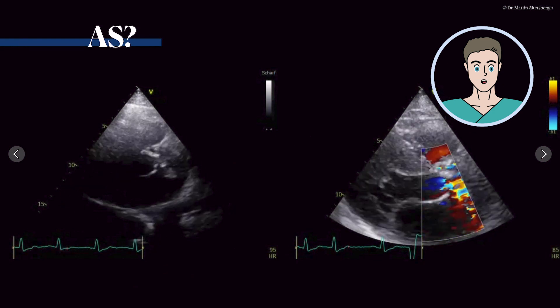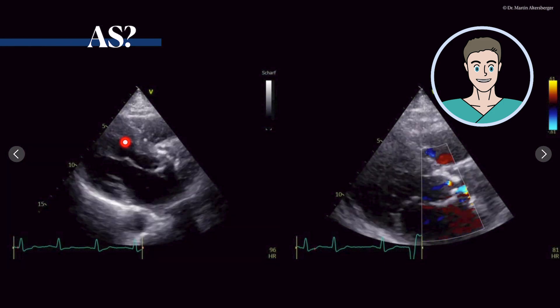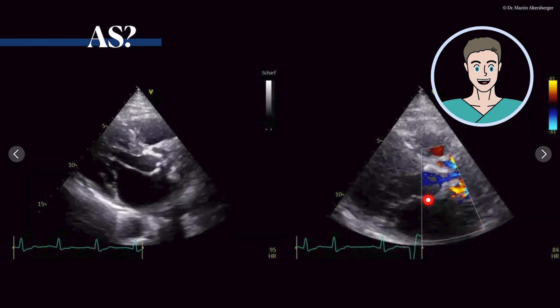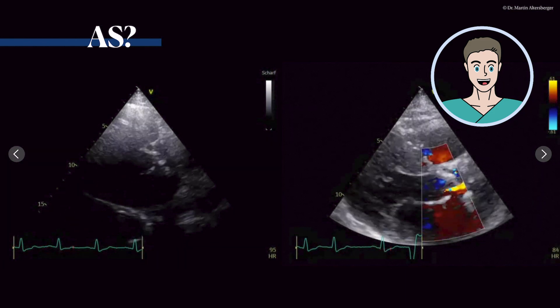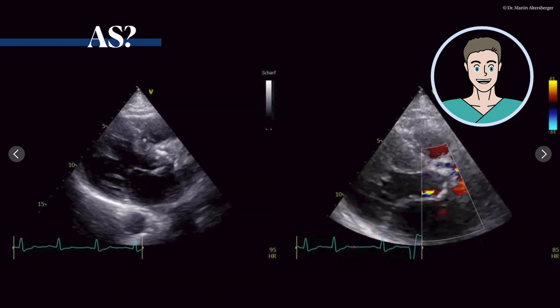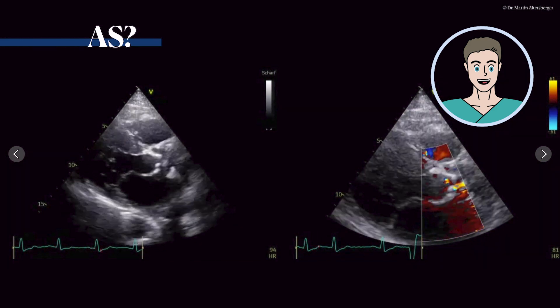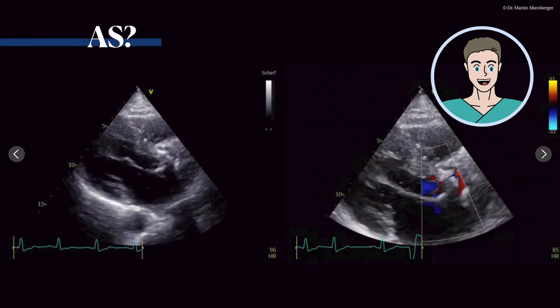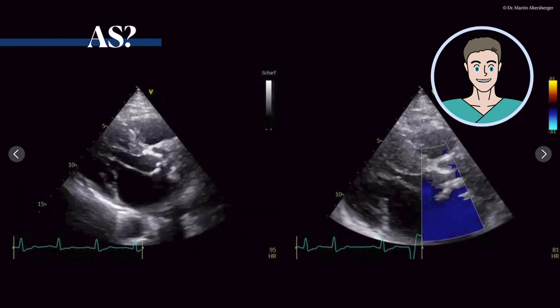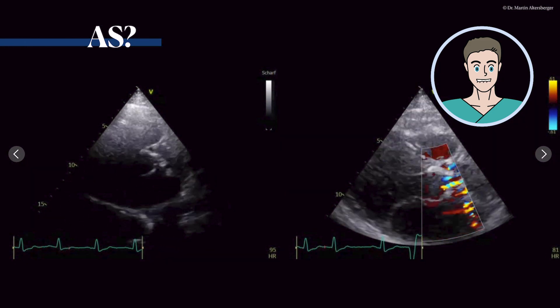Looking at Erna's full parasternal long axis view, we can see the LV cavity, the hypertrophied left ventricle, the right ventricle, the left atrium, the mitral valve, and the aortic valve in the center. Color Doppler confirms this is truly a severe aortic stenosis. The severe calcification means valve opening is greatly reduced. Color Doppler shows a small flare of aortic regurgitation, and prominent aliasing and turbulent flow after the aortic valve confirms a relevant, severe aortic stenosis.